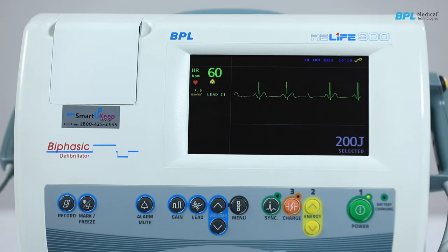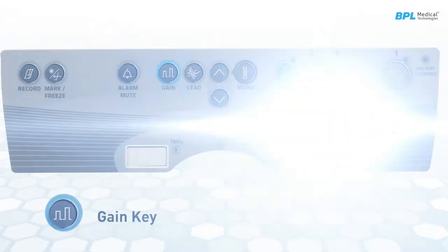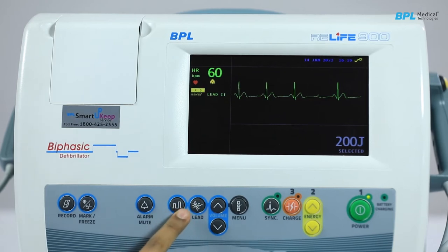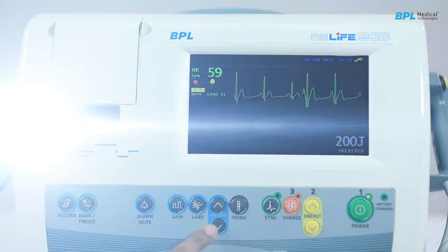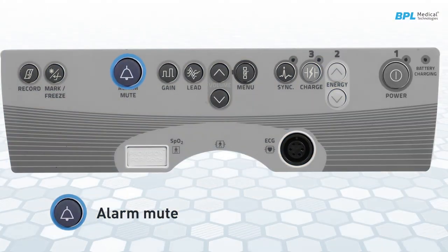Lead keys select the ECG lead that has to be displayed on the screen. Volume up and down keys are used to select the ECG source lead. Gain key is used for changing the gain of the ECG. Volume up and down keys are used to modify the gain settings. Alarm mute mutes the alarm sound.